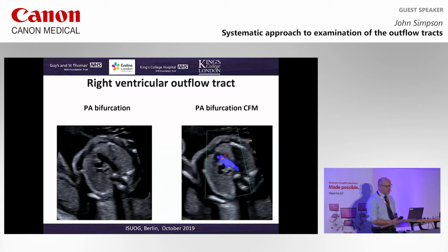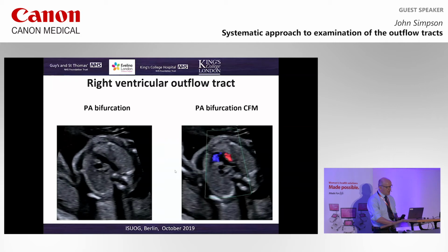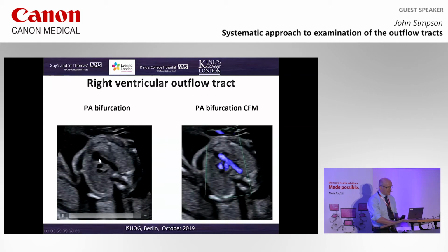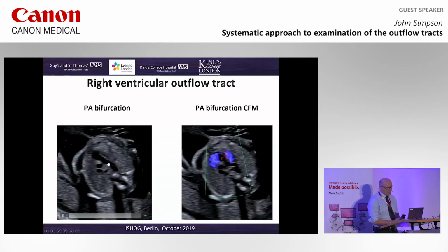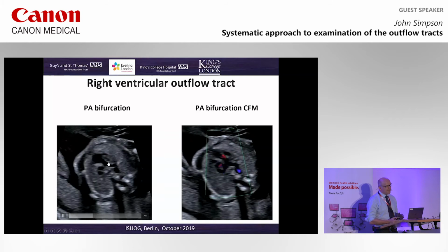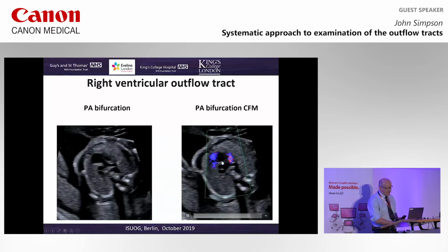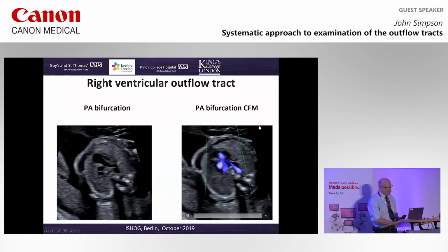the right as we look. The color helps you to see the bifurcation of the pulmonary artery, and you can see this lining up of the SVC, ascending aorta, pulmonary artery, and that pulmonary valve disappearing during ventricular contraction. Laminar flow across into the pulmonary valve and antegrade flow from the pulmonary artery down into the arterial duct to the descending aorta.